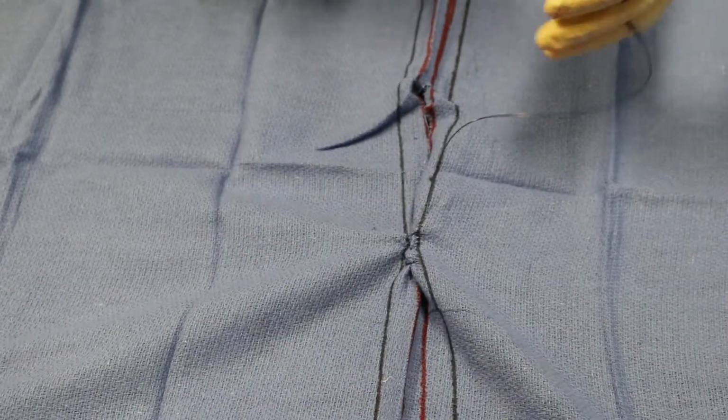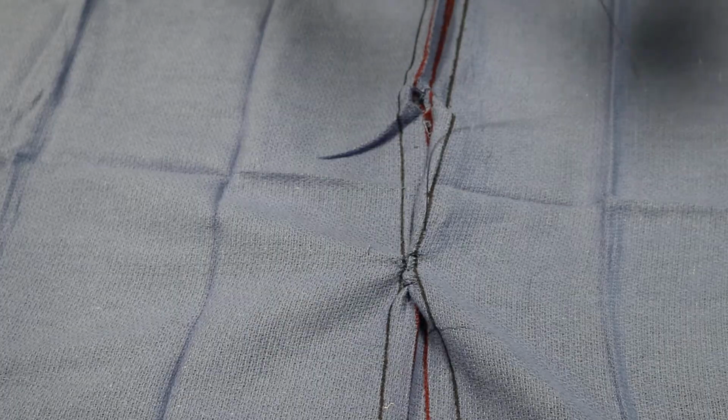And when you pull that tight, you'll see those two black lines are going to come together. There you go. And you can see, you can really appreciate how it's starting to invert.